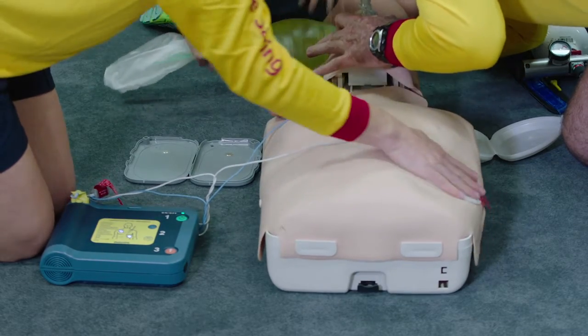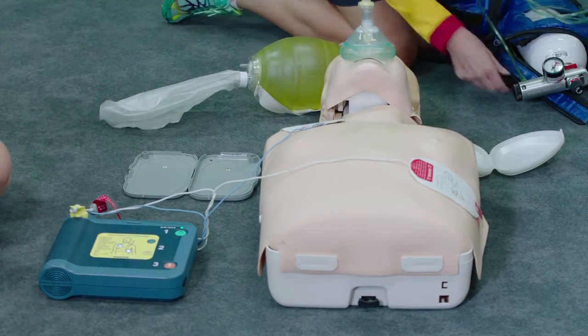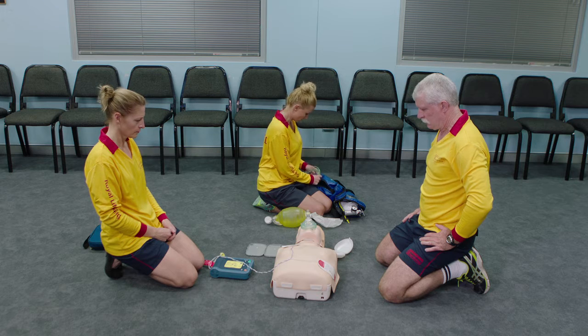The oxygen equipment can continue to be set up while the defibrillator is being attached and conducting its analysis. Stay clear of patient. Analyzing heart rhythm.